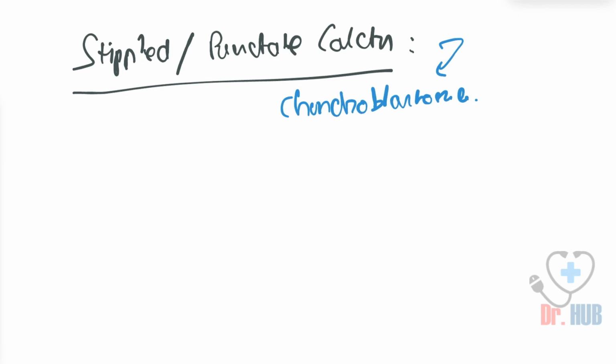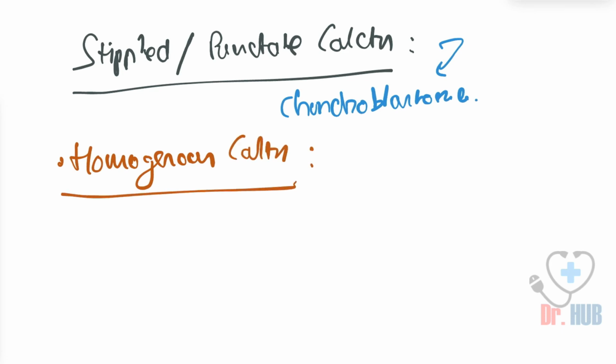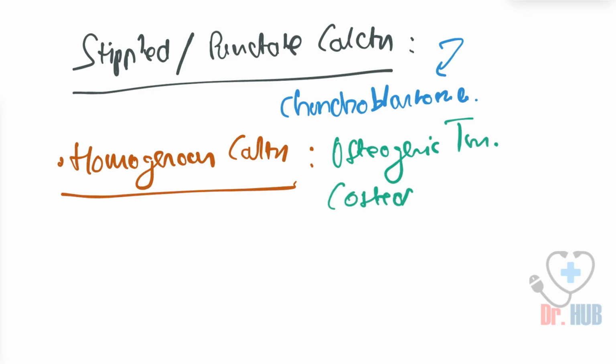And then we also have the homogeneous calcification. So what is this homogeneous calcification? It includes the osteogenic tumors. So that is the osteosarcoma.